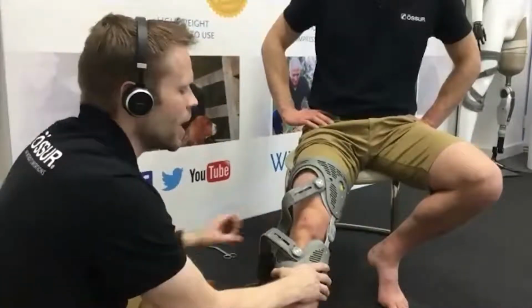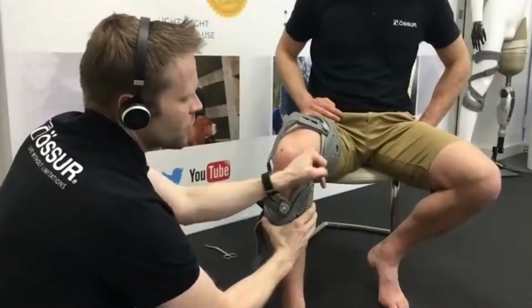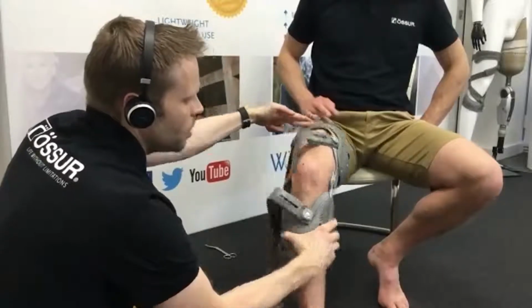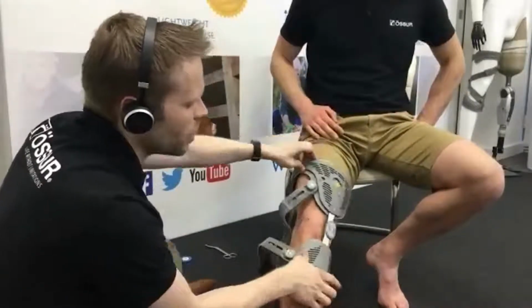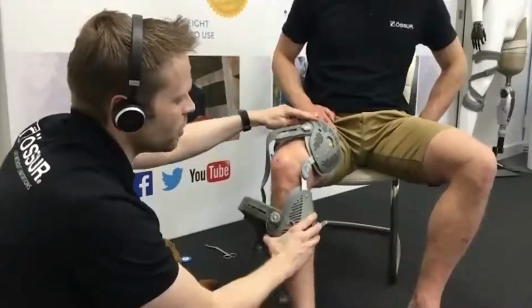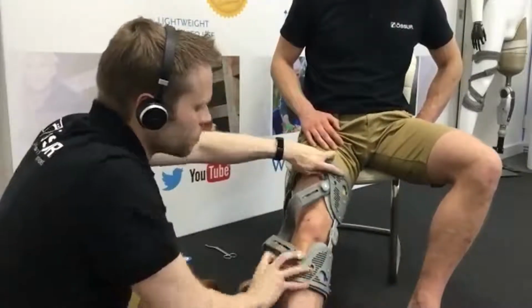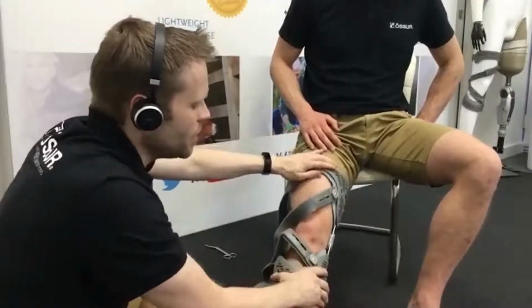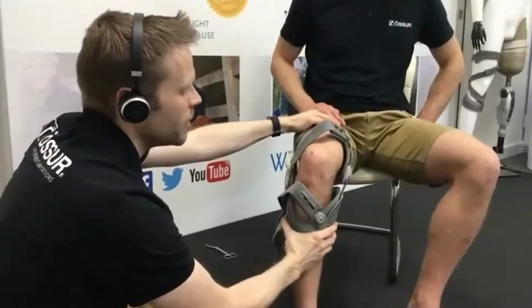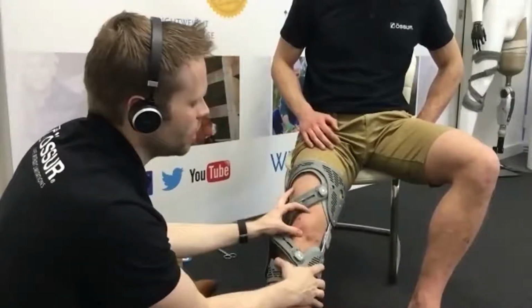So ideally, if Pete was to bend his knee, you can see that it will actually stay in position and follow in line with the center of the knee like that. You straighten again, Pete. The thing to check is that we haven't got it too externally rotated, because as we bend the knee, you can see that it shifts in towards the knee like that. And equally, go straight, Pete. If we position it too internally rotated, as we flex, can you see the hinge is pushed out more medially? So we need to make sure, get it nice and straight, that we've got it in line with the axis of the knee.